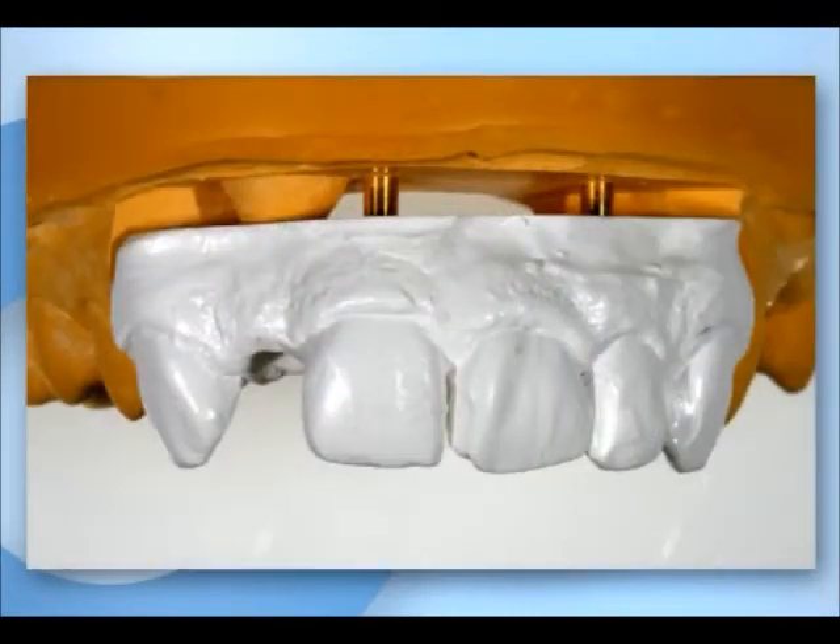A rigid, removable gingival mask is produced. In this case, polyurethane is used.